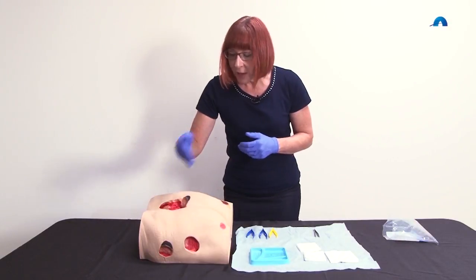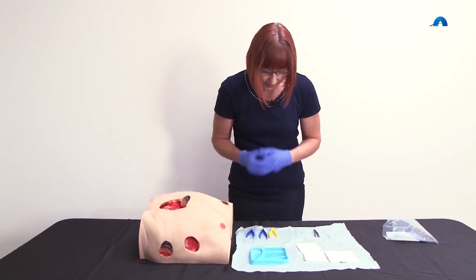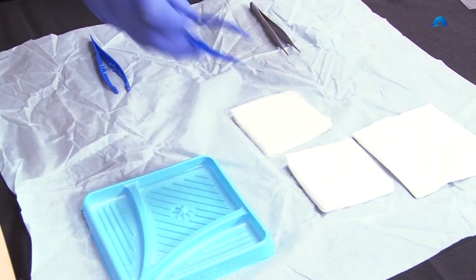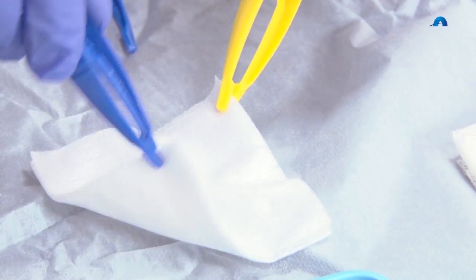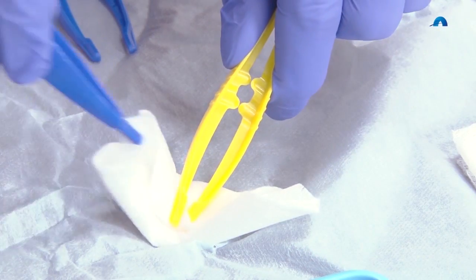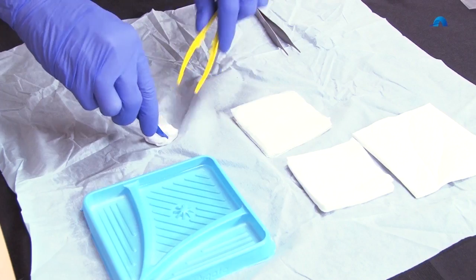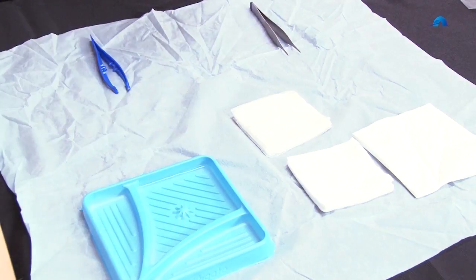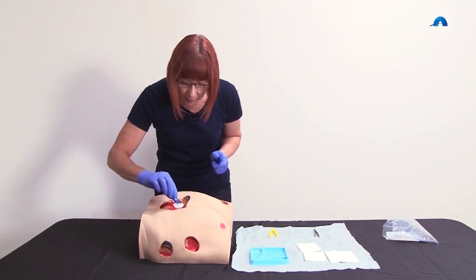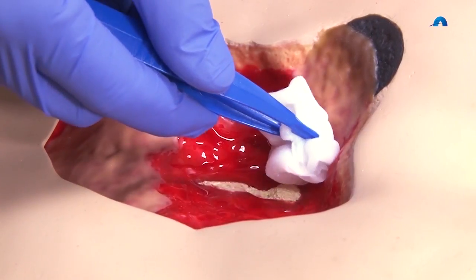Our granulation tissue needs to be cleansed using gentle techniques. We're going to use an aseptic non-touch technique to fold our gauze, moisten it with some saline, so that it can be used to gently clean the granulation tissue.